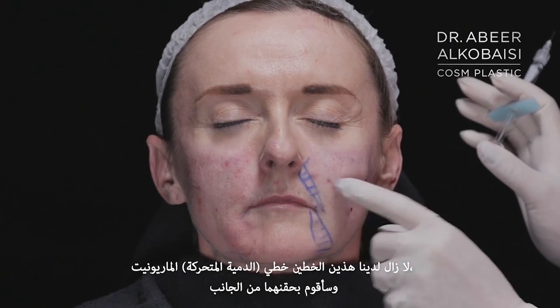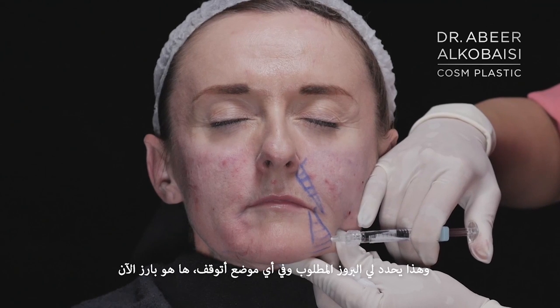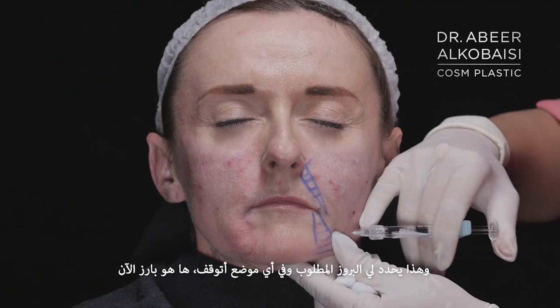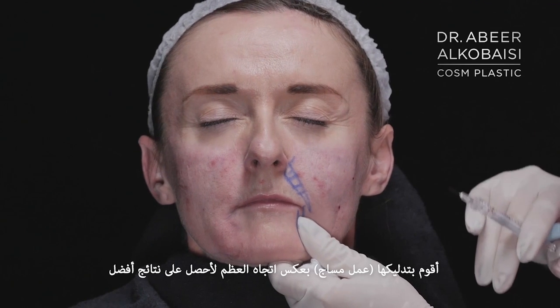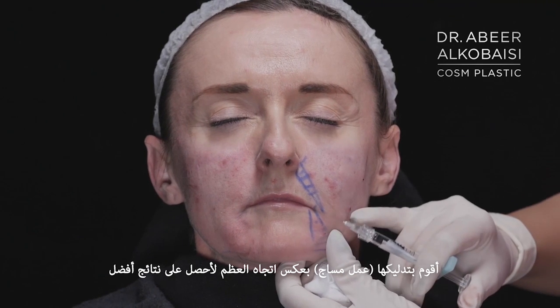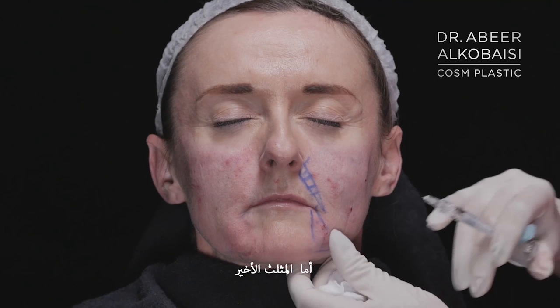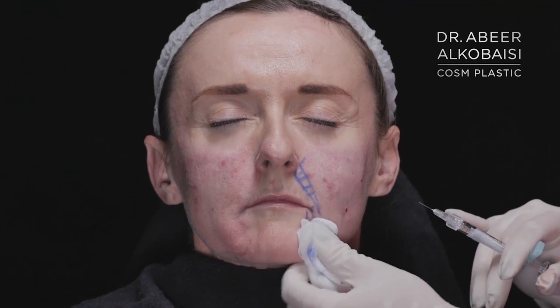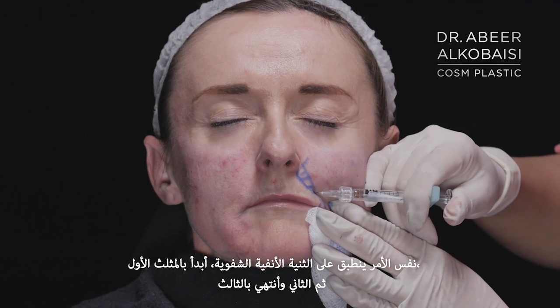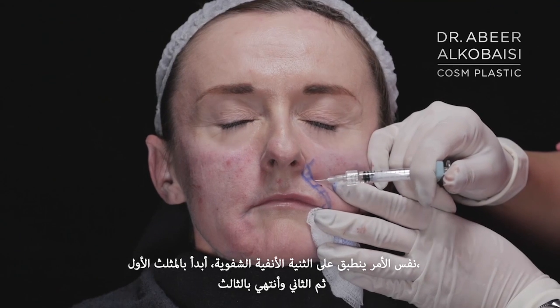So we still have these two lines, the marionette line from the side, and I go injecting, and it gives the projection where it asks me to stop. So it's already projected. And I massage it against the bone to give a smoother effect. The last triangle. And the last here. Same for the nasolabial fold. I go for the first triangle, second, and lastly the third.